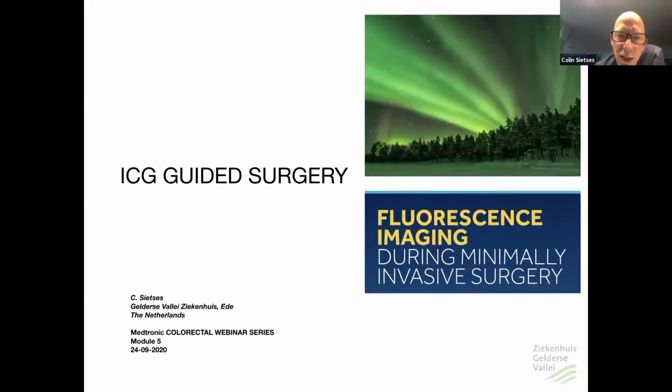But if you want to see it intravascularly, you have to give it and look immediately, because it circulates immediately. And the half-life, like I said, is 4 minutes. So in 4 minutes, it's cleared from the vascular system, so you don't see it anymore. So you have to give it when your system is ready to go. Otherwise, you can't see the effect anymore.